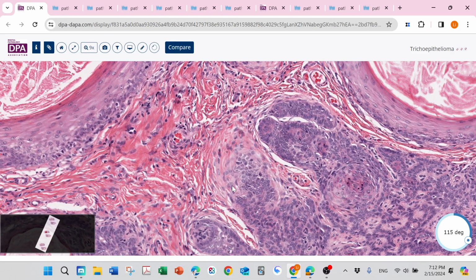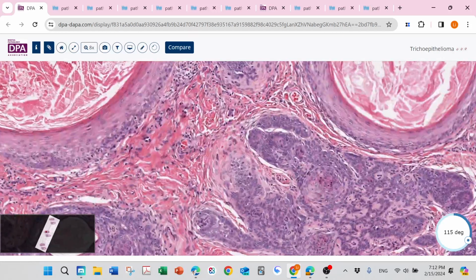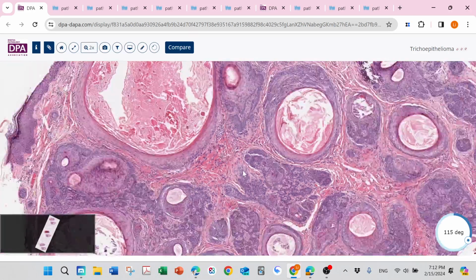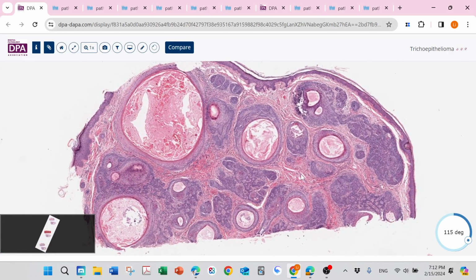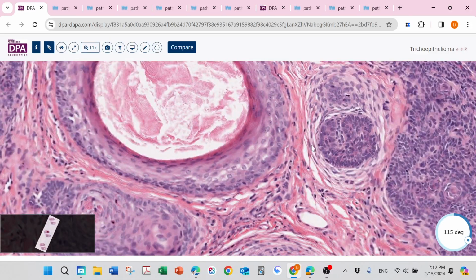But whatever, if you diagnose something like basal cell for a trichoepithelioma, I think even if you have this kind of nodule on your face, you still want to take it out. But remember the papillary mesenchymal body, that is basaloid cells hugged by these spindle fibroblast-like cells. This is a classic feature. When you see this feature, you are sure that is not basal cell carcinoma: papillary mesenchymal body.